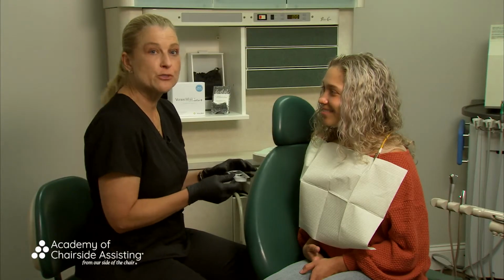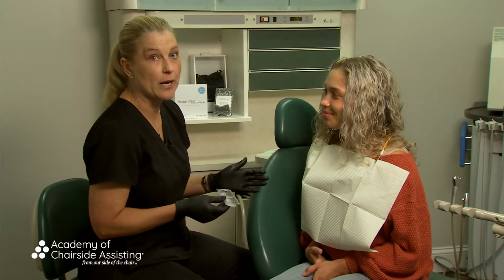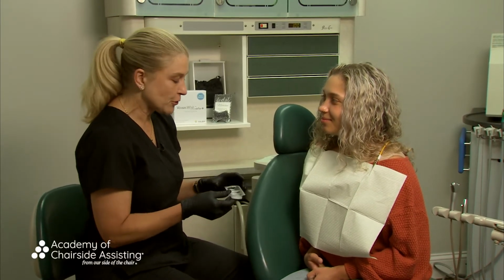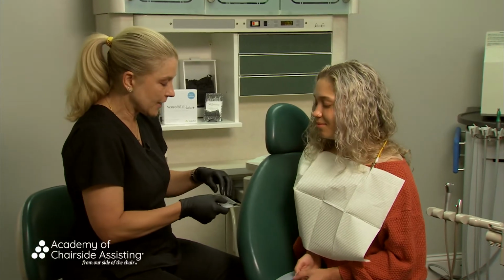So let's do Haley's first whitening treatment while she's in the chair. And I actually like to do this for patients because I want to make sure that they understand the process. And most importantly, again, we're going to get the best end results. The first thing that I'm going to do is I like to start with the lower tray. So I'm going to just kind of lift this out.